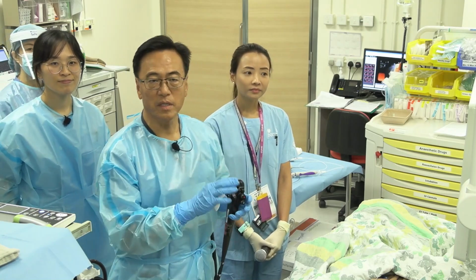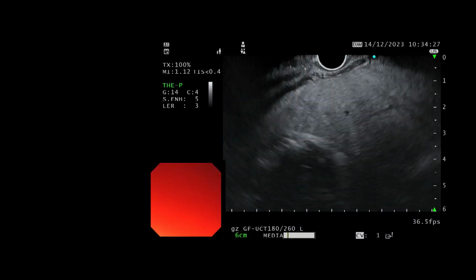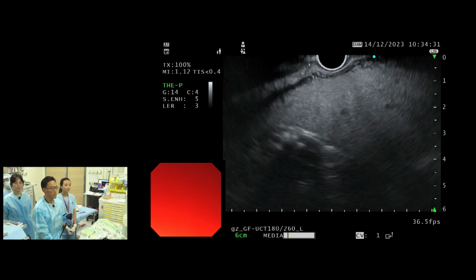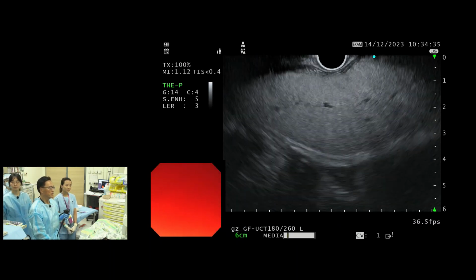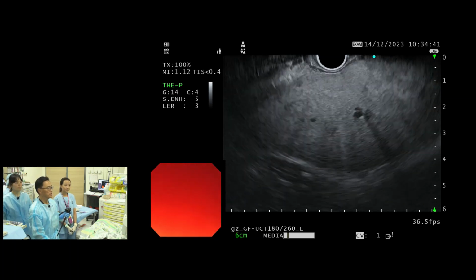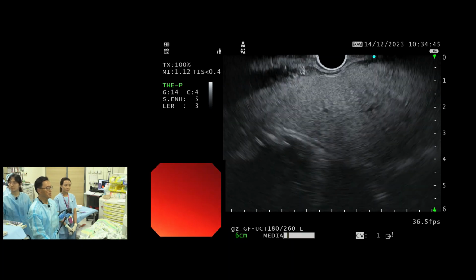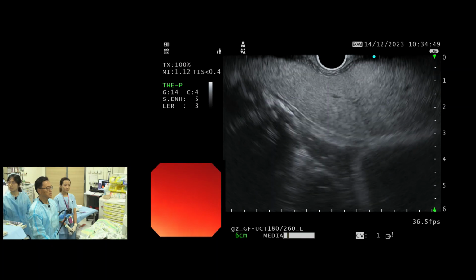Yeah, so first I wanted to show you the images of the liver. Are you seeing the EUS? Yes. We have the EUS video here. Okay, so now I'm imaging the left lobe of the liver, and the liver echotexture is slightly hyperechoic, which goes along with steatosis. I'm going to do a quick indentation here, palpation, and as I palpate, push, release, push. It's a stiff liver.